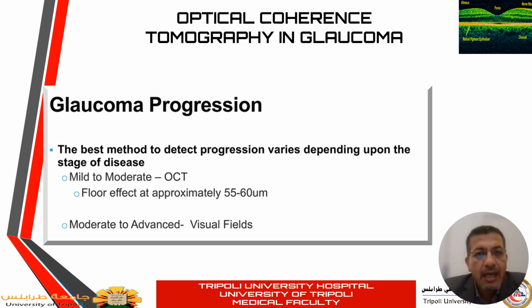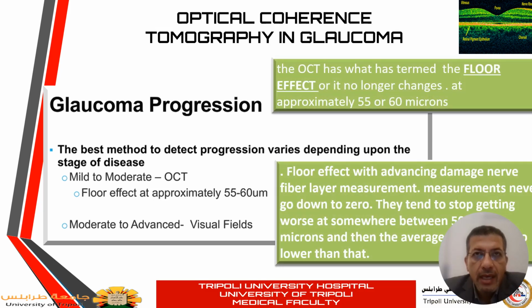So to sum up, for advanced cases of glaucoma, because of the floor effect of the OCT, visual field is better than OCT in establishing the progression analysis. However, in early stages, OCT will be better. And the floor effect, what's the meaning of a floor effect?